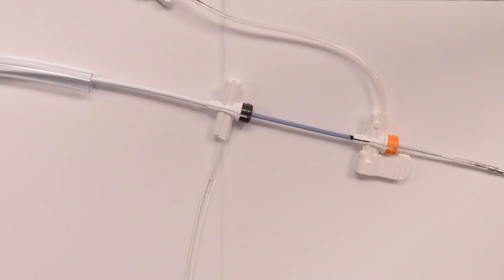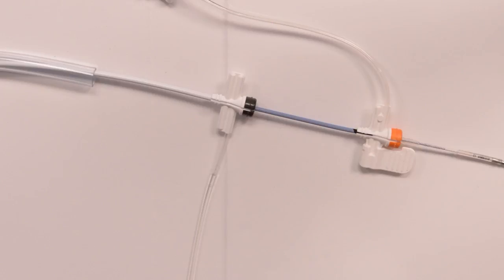One of the many benefits of the Whirly system is the ability to slice the catheter in a really stable way. Historically, EPs have had a lot of issues pulling back a lead when they go to slice the inner or outer catheter. With the Whirly system, we're able to slice in a way that keeps the lead in place and the anxiety that all physicians feel hopefully goes away. After spending 45 minutes to two hours placing a lead, nobody wants to pull that lead back to redo it.